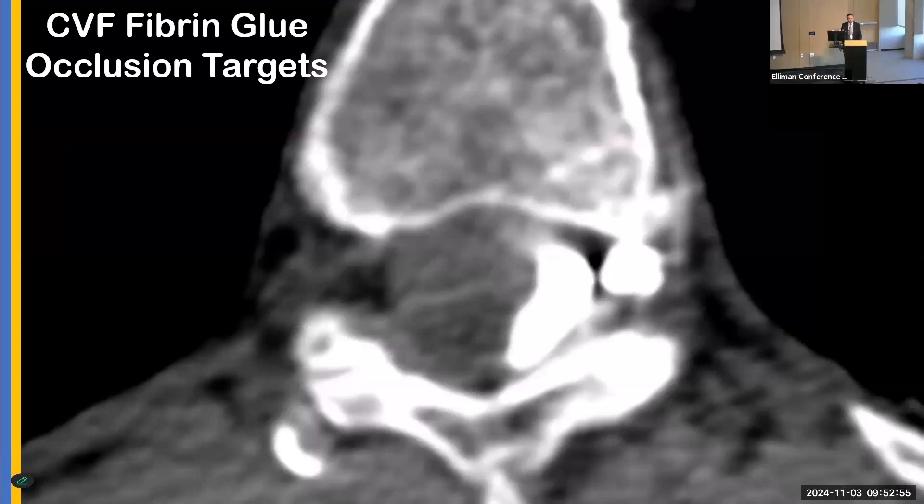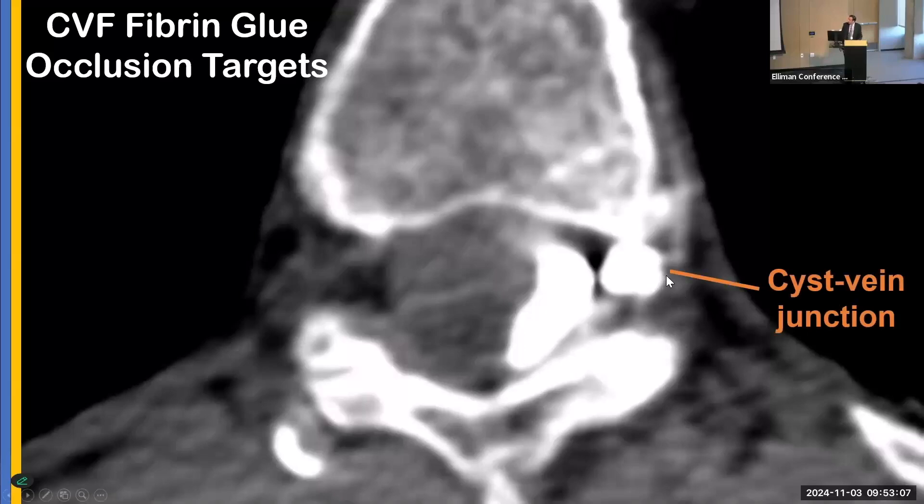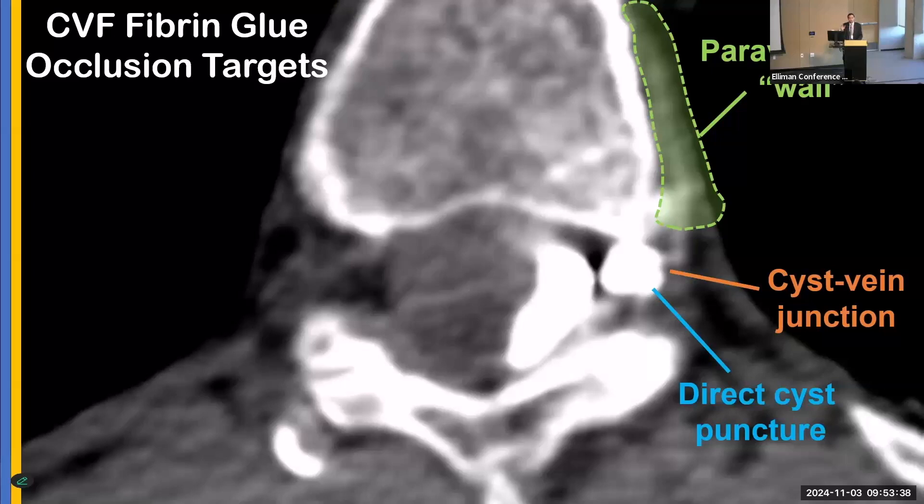Where exactly do you inject when performing fibrin glue patching? For a CSF venous fistula, there are two main targets. One is at the cyst-vein junction, and the second is in the paravertebral wall. We target these sites approximately 99% of the time. You might use one needle to address both the cyst-vein junction and the paravertebral component, or two separate needles. For unusual cases such as intraosseous CSF venous fistulas, a direct cyst puncture may be performed, though that's not our first approach for routine cases.